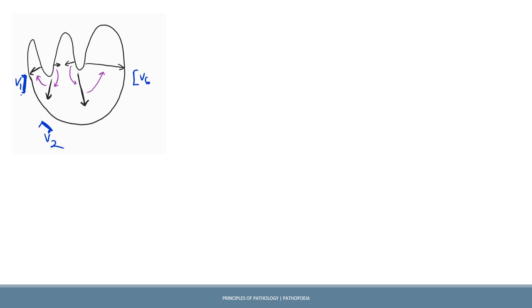Okay, so here I have kept a transverse picture of the heart with the leads V1 and V6. Now the chest leads show a transverse view of the heart, and V1 and V6 are generally preferred because they are the most away from each other, and hence they have contrasting features.